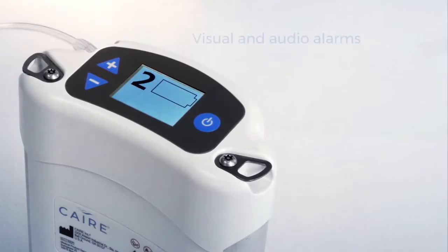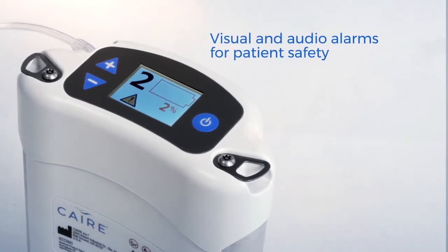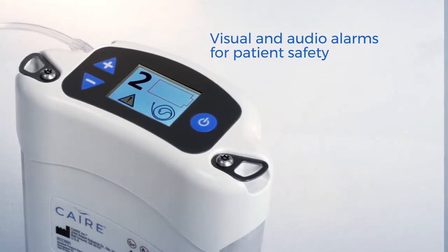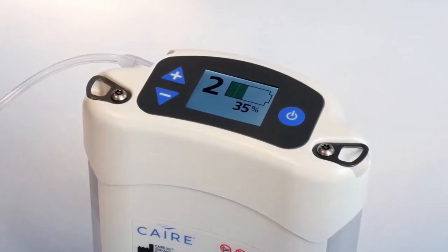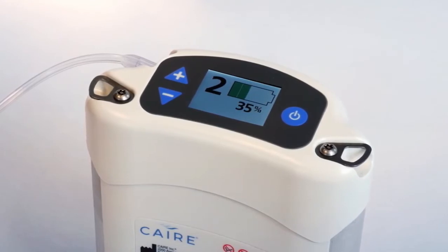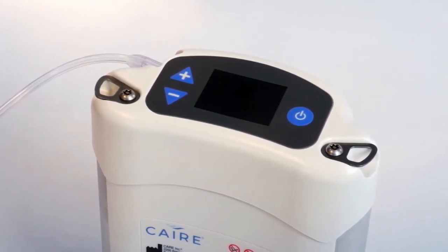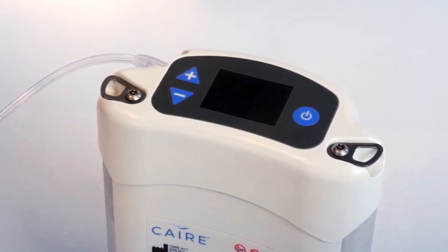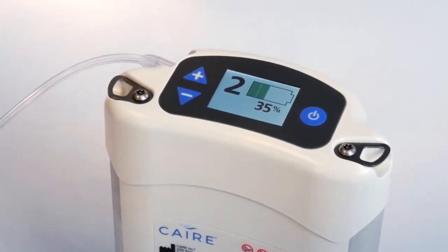Should an alert occur, you will hear an audible alarm and see symbols appear on the display screen of your device. You will need to refer to the troubleshooting table in the user manual to determine the type of alert, and then contact your home care provider or Care technical service for assistance. If a button on your Freestyle Comfort has not been pressed in 20 seconds, the display screen will dim. Even though the screen has dimmed, the unit will continue to run. To wake up the display screen, simply press any of the control panel buttons once.